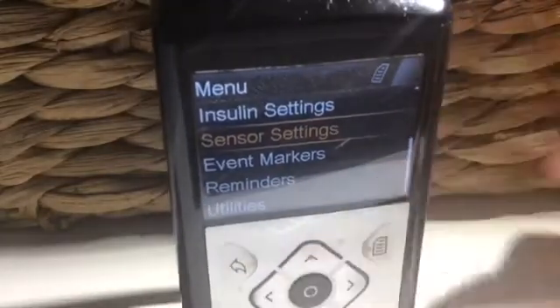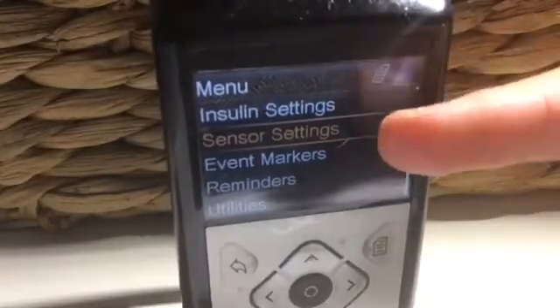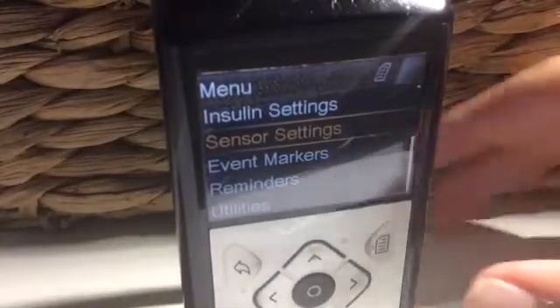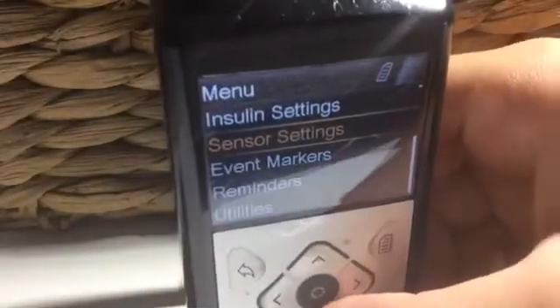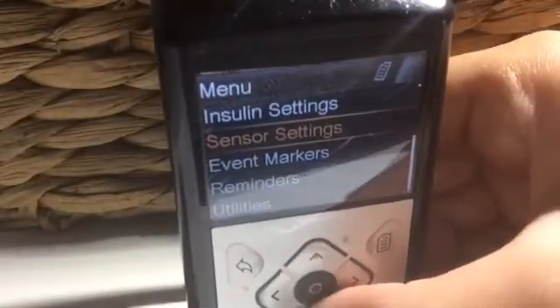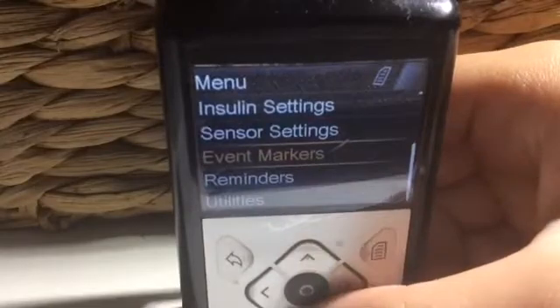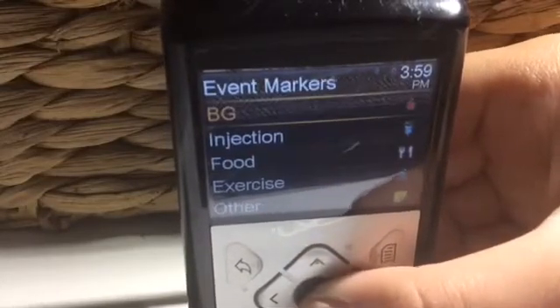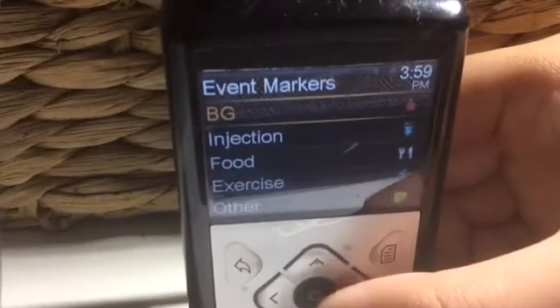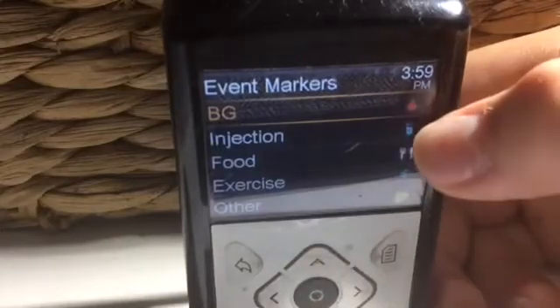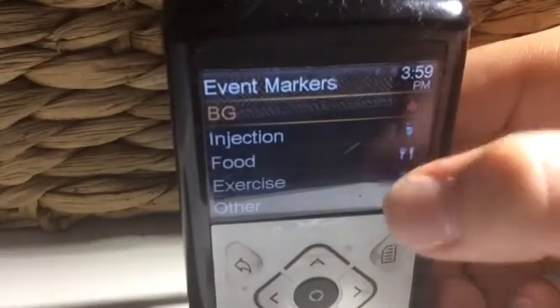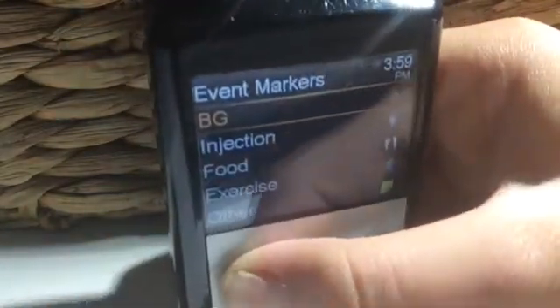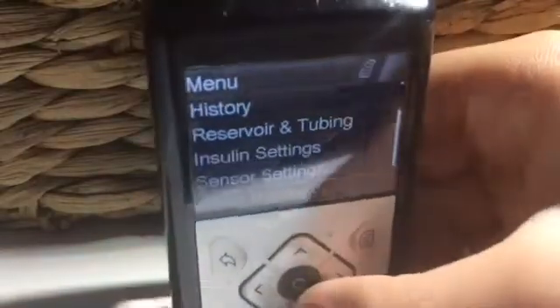Next, sensor settings — there's a video for that too that you can go visit and see how that all works. Now, event markers — you can use that when you're doing something that you wouldn't normally do, like exercise or something else, and you want to record it to see patterns.